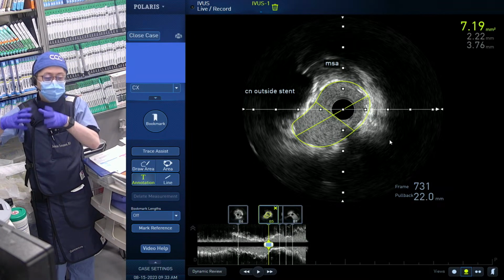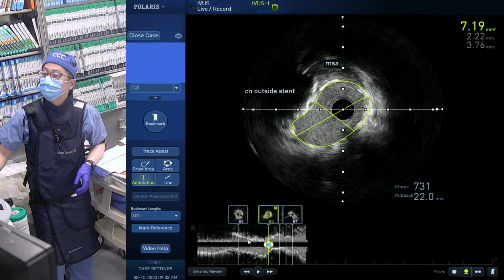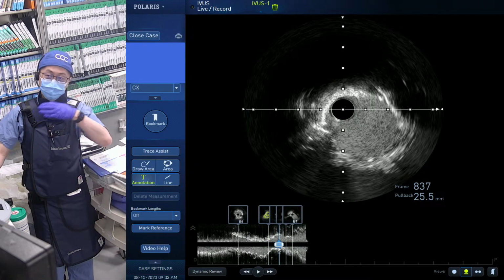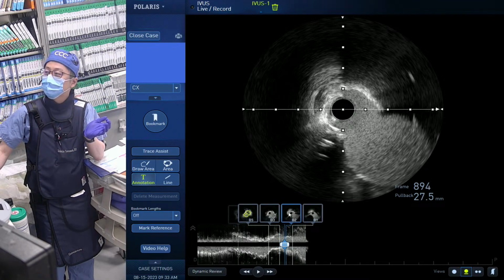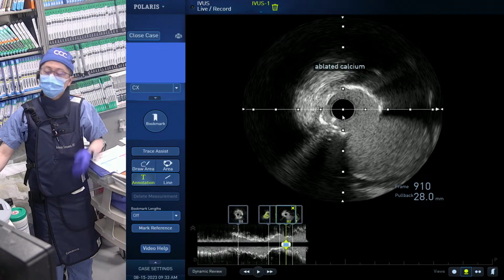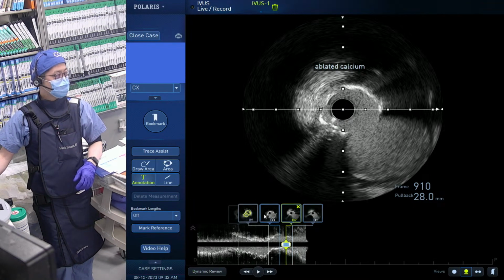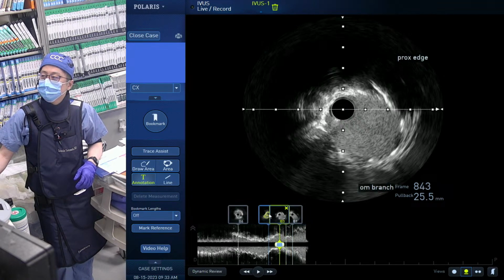So if it's an aggressive balloon, there's a risk of perforation. So it's a safe and good result. If we go to the proximal edge, this is on the plaque, but normal position also. We didn't come all the way to the proximal, so normal position. And beautiful, actually, proximal circ, this is like a snowman shape. So this is where you ablated. That's why every device goes through the lesion. So this is a good plaque modification. Stenting is perfect.